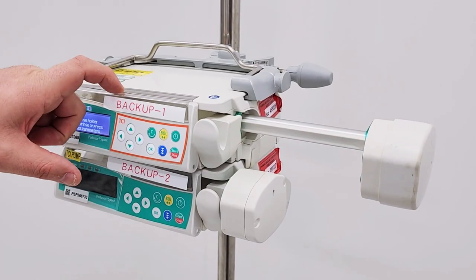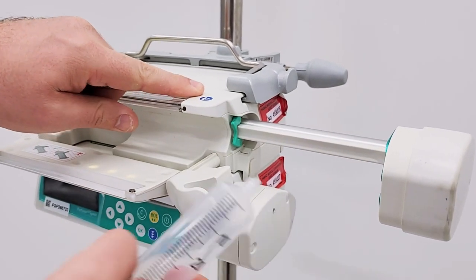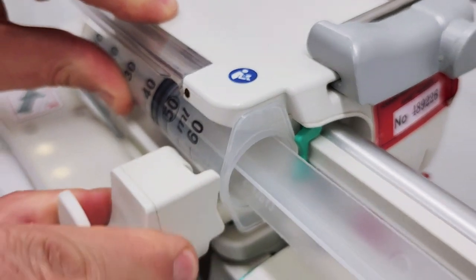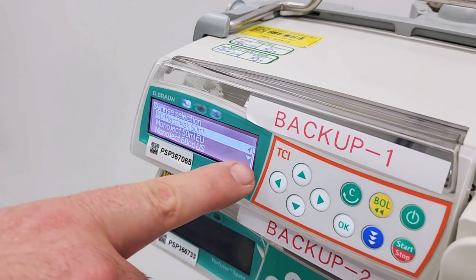To ensure the correct insertion of the syringe, open the door. Pull the syringe holder and turn it to the right. Insert the syringe and apply the holder. Then close the door. Select the appropriate brand of the syringe and then validate.